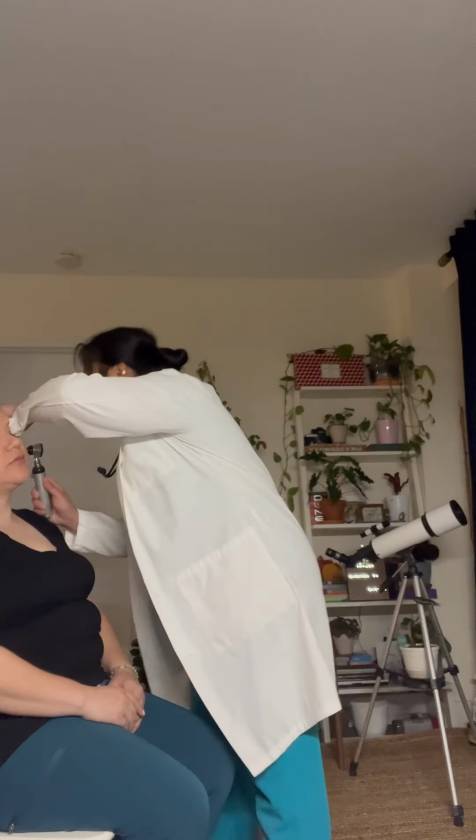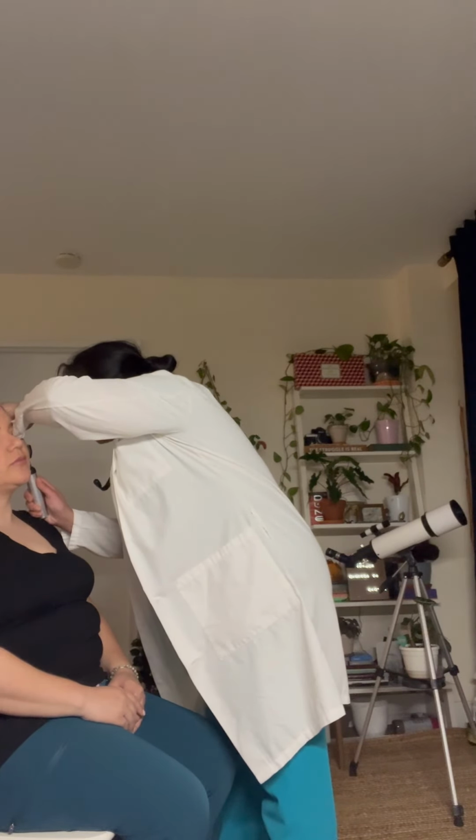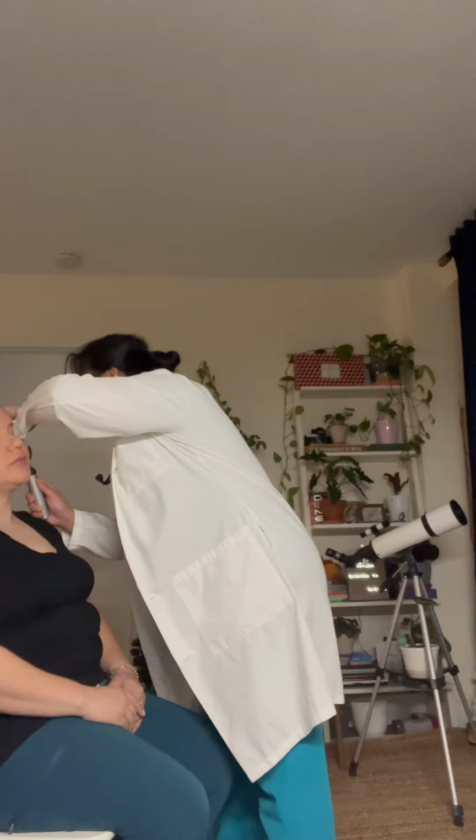I'm pulling it up and back. Okay, tympanic membrane is visualized. It's pearly gray, intact, no perforation, no scarring, bleeding, or drainage. Minimal cerumen noted. No masses, no lesions present. Cone of light at 7 p.m. Malleus and pars flaccida intact and noted.